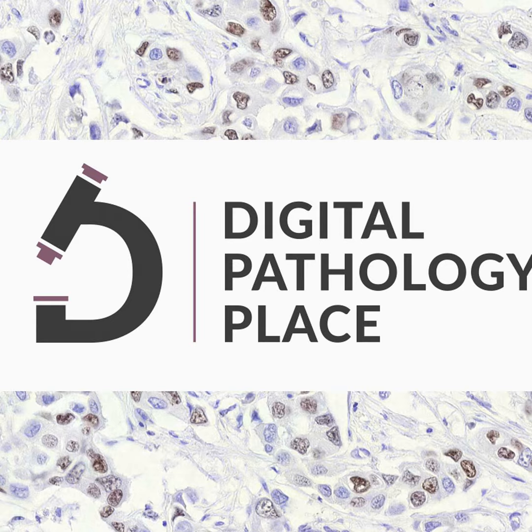Also there are AI-based models to enhance the detection of hepatocyte ballooning and metabolic dysfunction associated steatohepatitis, minimizing inter-observer variability. You know what? Whenever there is an observer, aka pathologist or radiologist, whoever, there is variability. And we want this to improve clinical trial enrollment criteria.